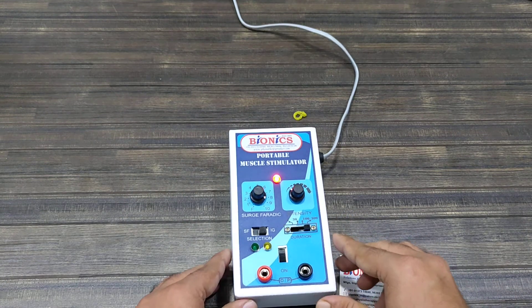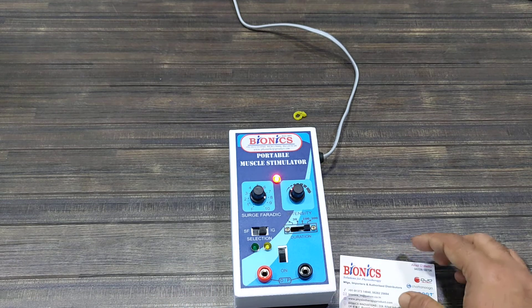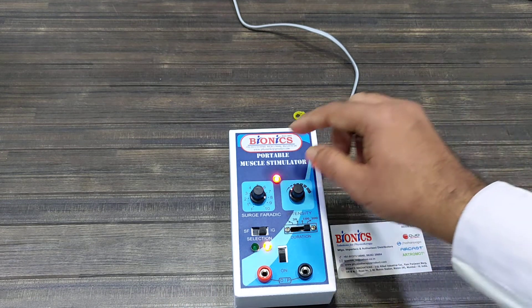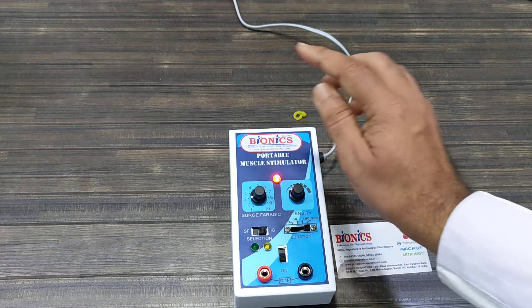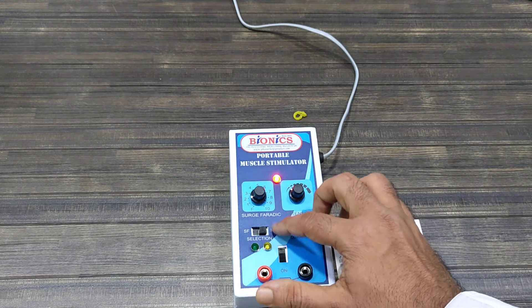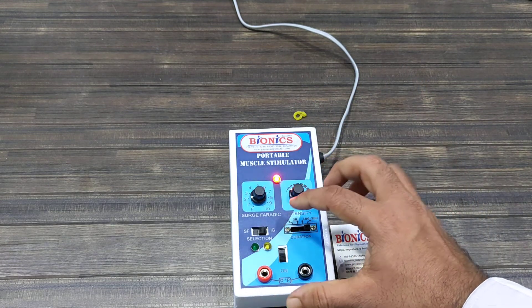Here you can see this is a single channel with two electrodes. This is the faradic option, and this is the IG — interrupted galvanic — and faradic.